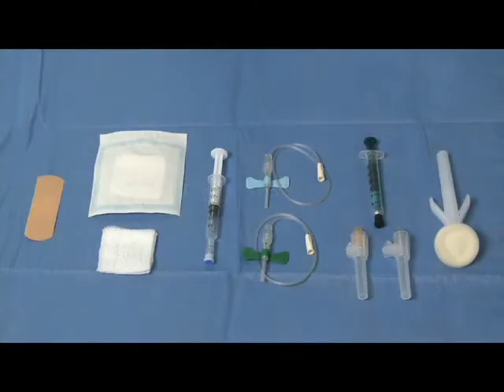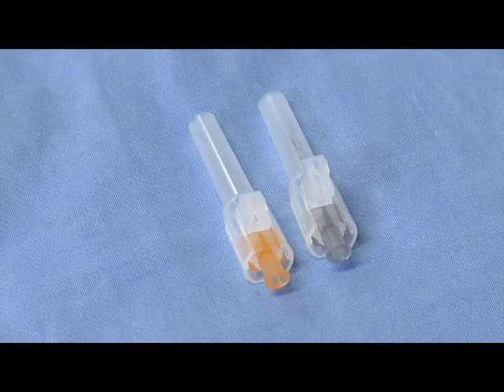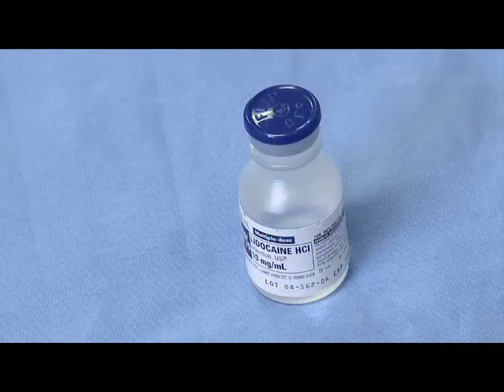The equipment required for performing percutaneous arterial blood gas sampling is skin cleanser, antiseptic, or chlorhexidine swabs. Optionally, and for selected patients, a 25 gauge to 30 gauge needle and 1 cc syringe with 1% lidocaine may be used for local anesthesia.